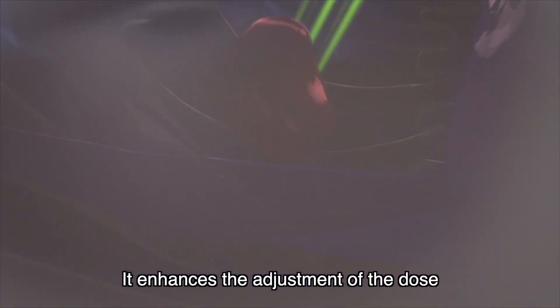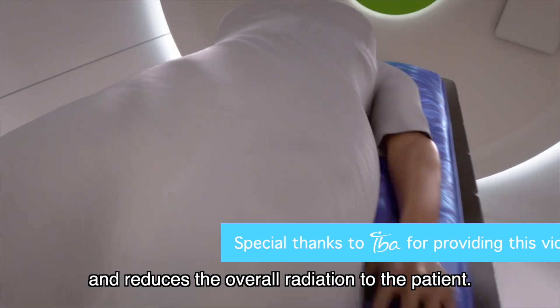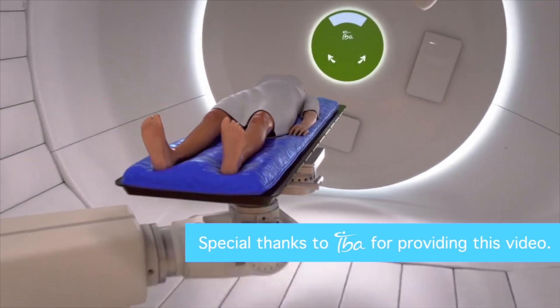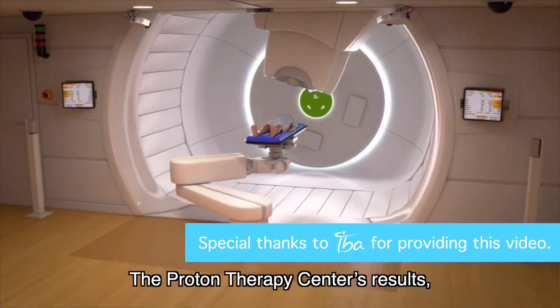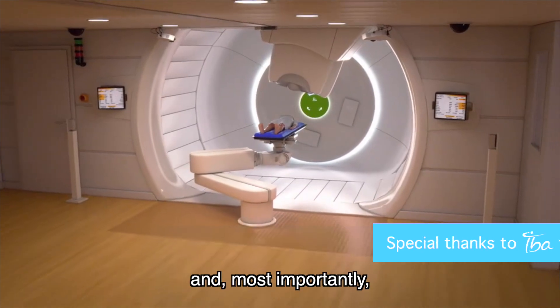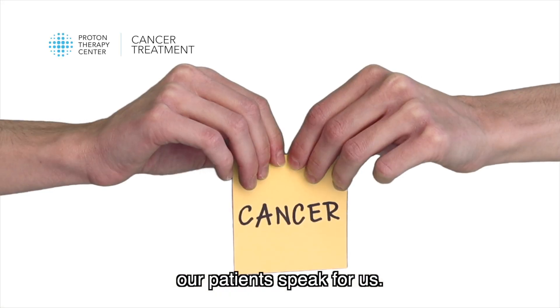It enhances the adjustment of the dose and reduces the overall radiation to the patient. Proton therapy is the most gentle method of treating cancer. The Proton Therapy Center's results, experience, and most importantly, our patients speak for us.